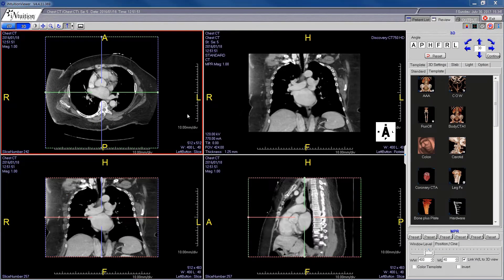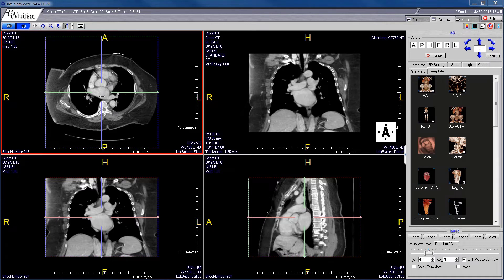This is the typical layout for a CT scan in the viewer. We have the source images in the axial plane. Remember in radiology we view the patient from the feet, so the patient's right is on the left side of the image and the patient's left is on the right side. Anterior is to the top of the image and posterior toward the bottom. There is also a coronal plane and a sagittal plane, reconstructed from the axial planes.